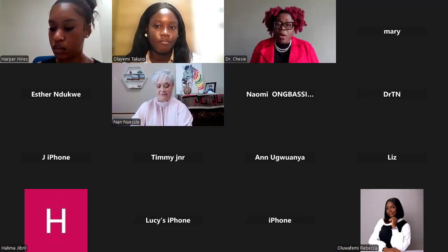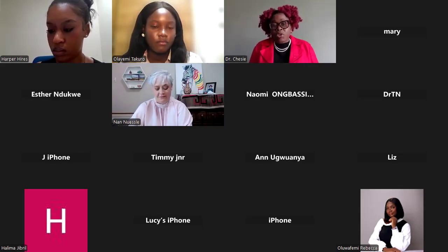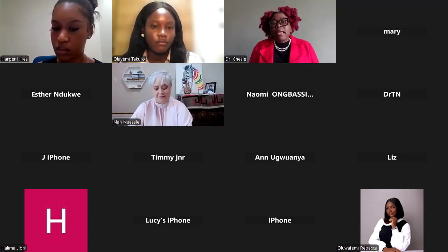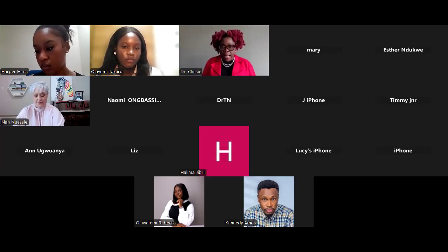For example, hemoglobin A1C, there are 8 different manufacturers of hemoglobin A1C. In these 8 different manufacturers, there are 4 different methods, implying that these 4 methods have different chemistries that could be affected. So it all depends on, okay, my doctor needs me to do this test at LabCorp, or we need to do it at Quest Diagnostics. When you say it, we know the method that is used by the lab, and then we can go down the hill to be able to ask the right questions with respect to you as an individual.